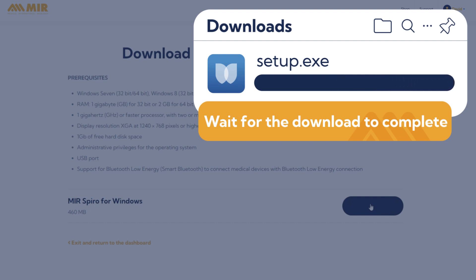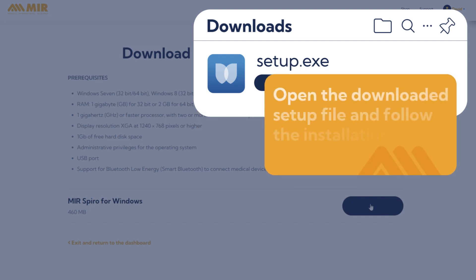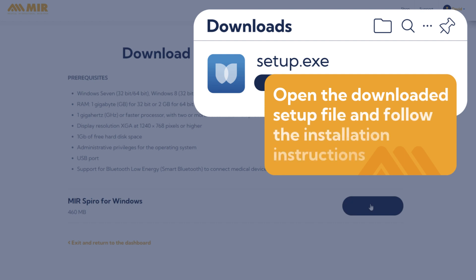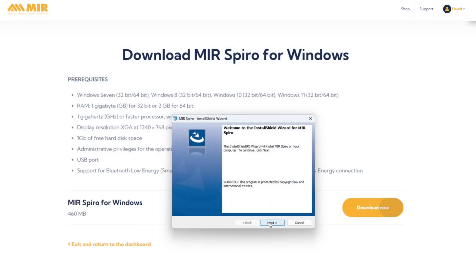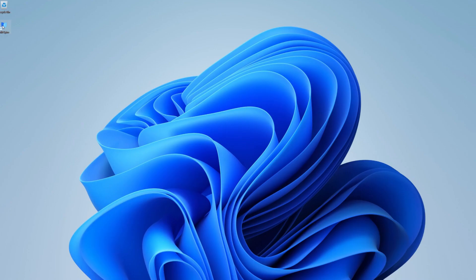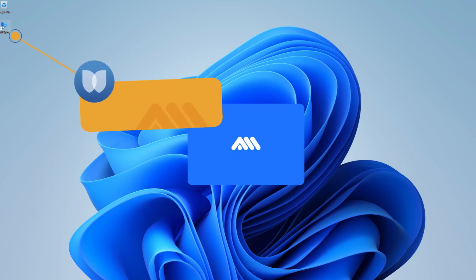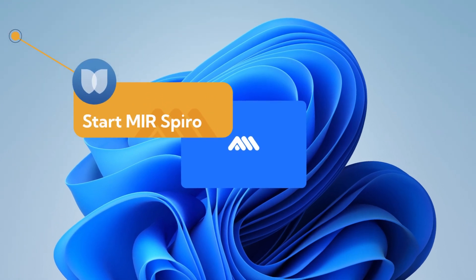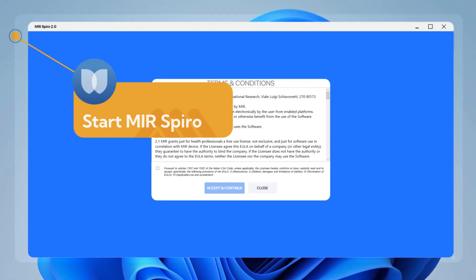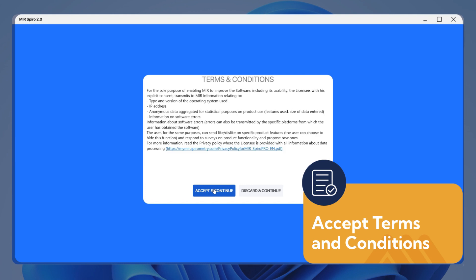Then open the downloaded setup file and follow the installation instructions. Once MIR Spiro Software is installed, start it and accept the terms and conditions.